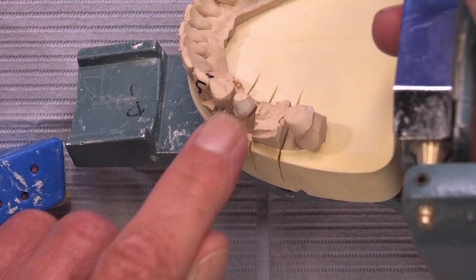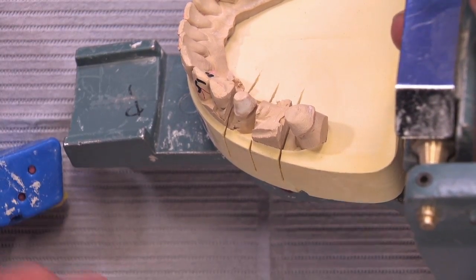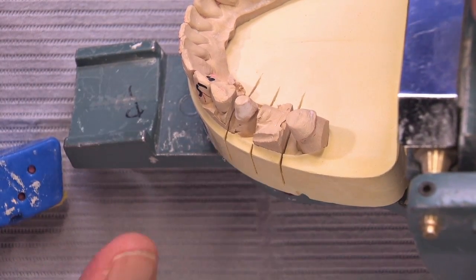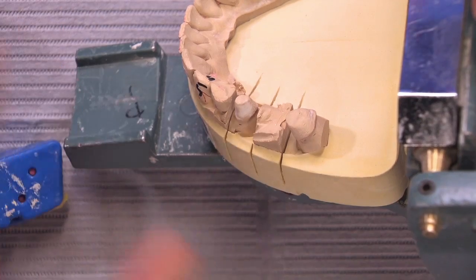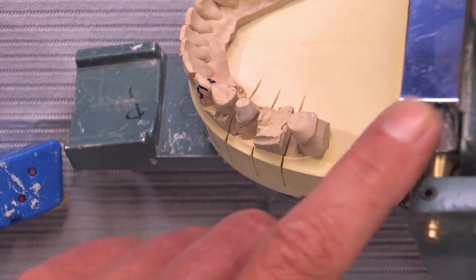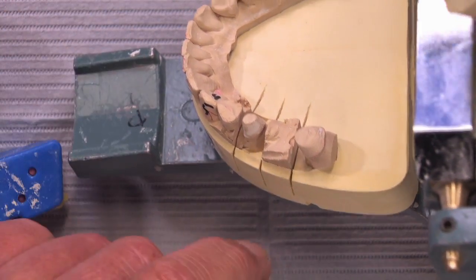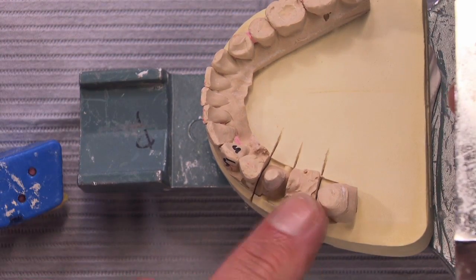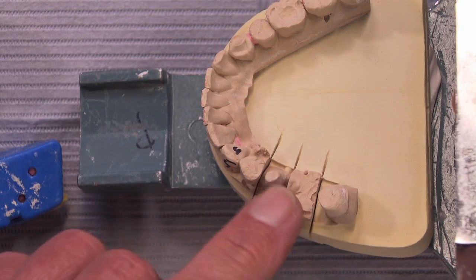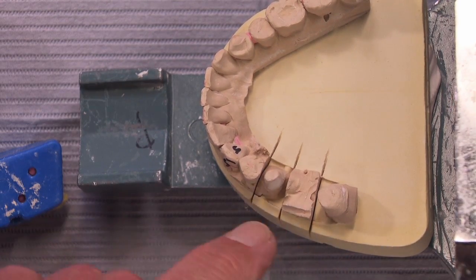I just don't think that having metal margins showing down here is that big of a deal, unless this was a patient who said, hey, no metal, I'm allergic to every metal found on the planet. I use plastic forks and spoons at home. That's how allergic to metal I am. In fact, don't touch me after you've touched that articulator. I will break out in hives. Unless they say something like that, I'm going to go with a PFM bridge here instead of a BruxZir bridge because there still is a chance this bridge can fracture. It's still an all ceramic restoration.